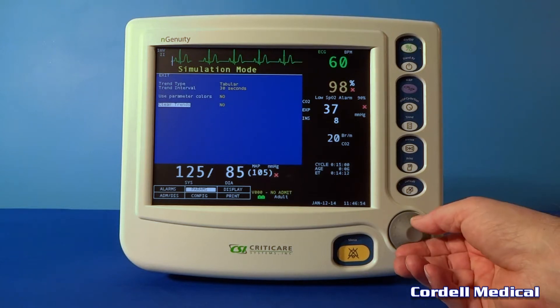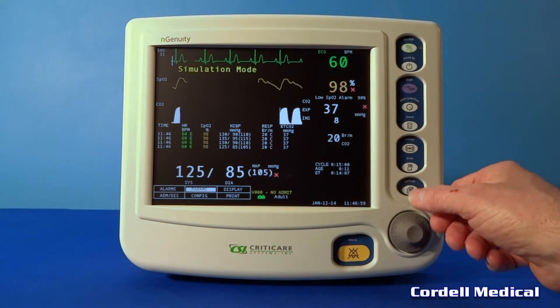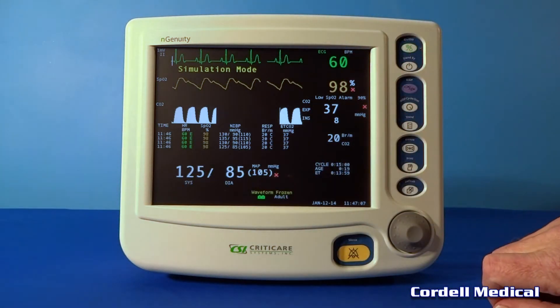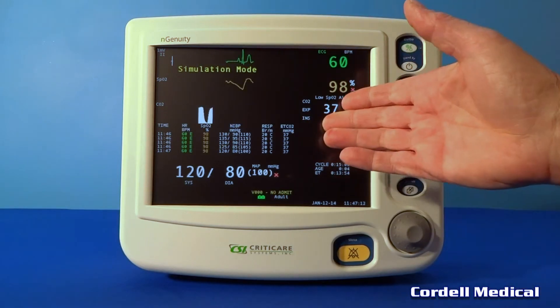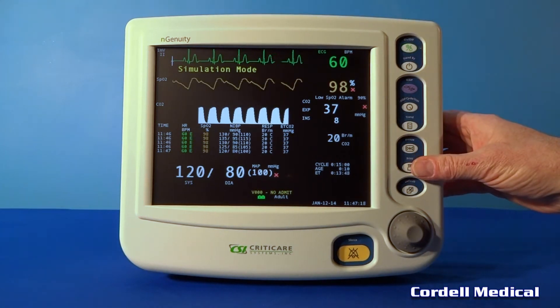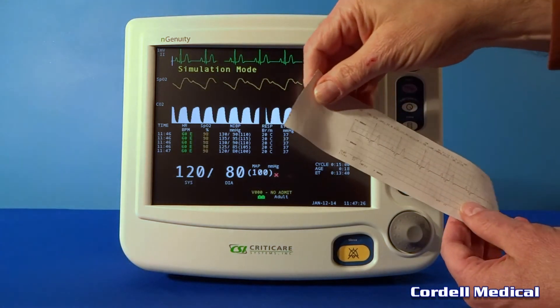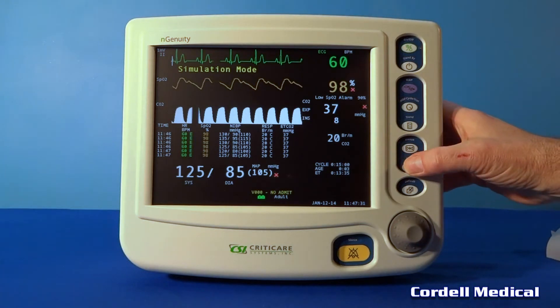I'm going to go ahead and leave those trends for now. The next button down is freeze — it freezes all waves on the screen. Press again to resume a continuous waveform display. Press the print key to begin printing; this is a graphical display. Press and hold to print a trend.